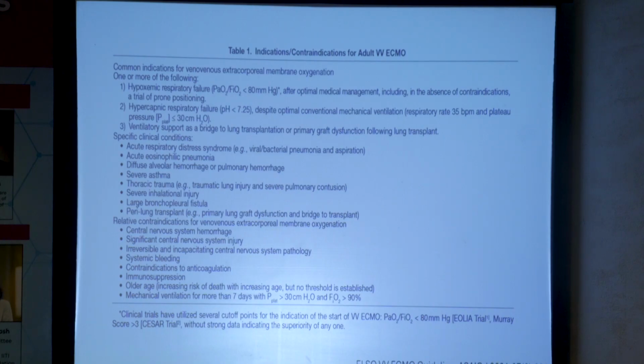And often, you don't necessarily need ongoing anticoagulation with VV ECMO, but you often need at least some anticoagulation to go on VV ECMO, and you may very well need anticoagulation going forward. VA ECMO, which I'm not going to talk about, you absolutely need anticoagulation. If you have a patient who has a 100% contraindication to anticoagulation, that is a consideration.